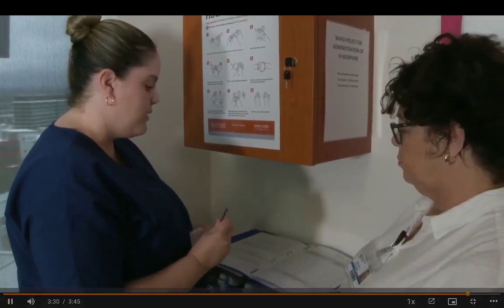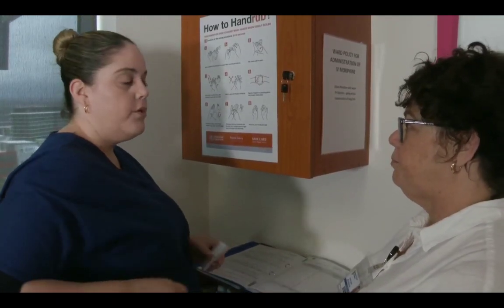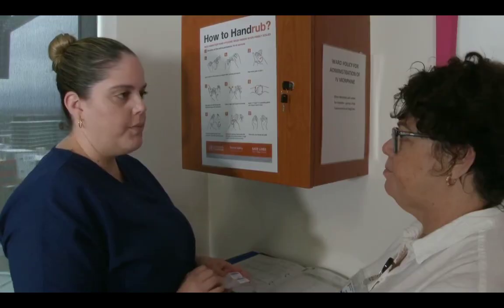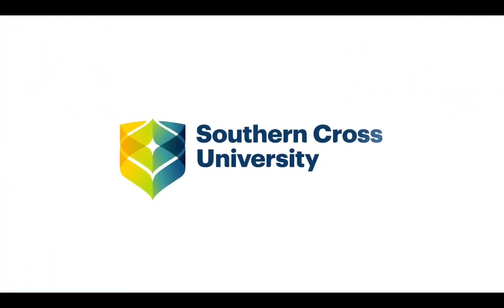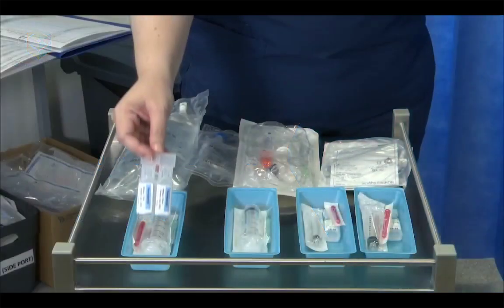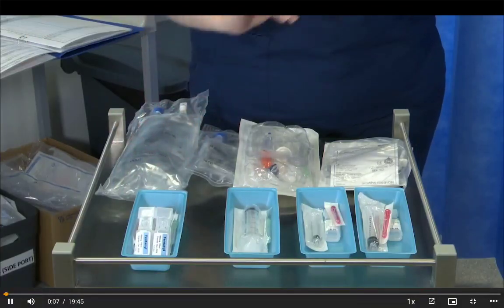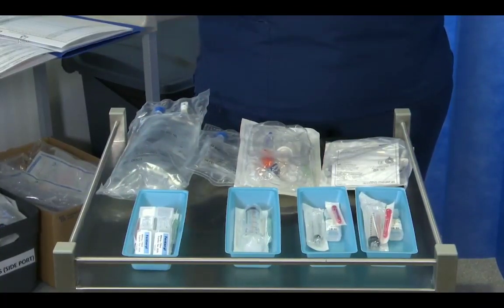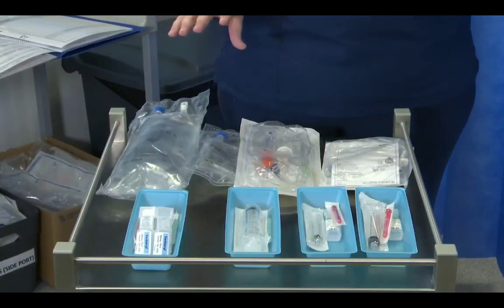I've got some bits and pieces all set up in the treatment room, but you'll need to come with me because this is an S8 medication, so you need to stay with me until we press start on the machine. Indeed. Thank you. Our DD medication, the 2 RNs will be together for this, and we are going to place the fentanyl into the fentanyl tray, remembering that we have to make sure that we keep that separate so that the fentanyl is always accounted for.